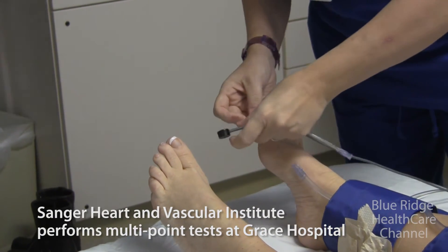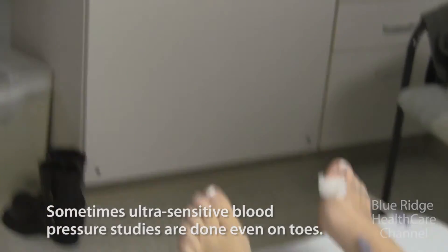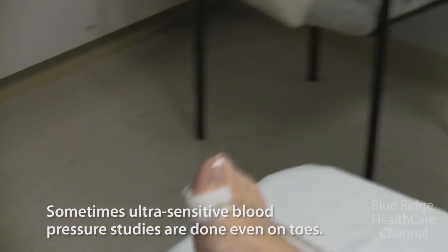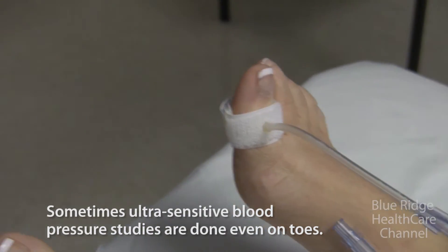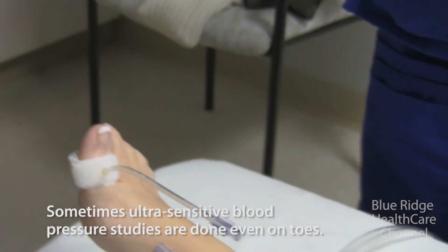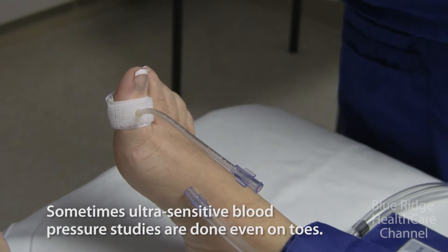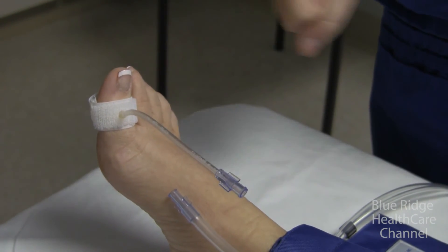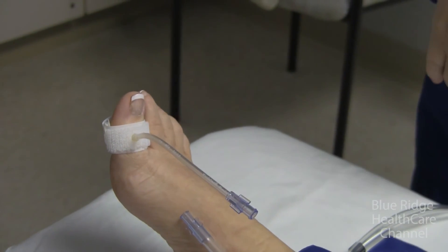With diabetic patients, they get calcium in the artery walls, so the blood pressure isn't always accurate because the cuff can't compress the artery the way it can in non-diabetic patients. It doesn't happen as much in the toe vessels, so a toe pressure is more accurate for somebody who's diabetic. Or if you've got an ulcer on the end of a toe that won't heal, you can take a blood pressure right there and see if that toe is getting enough blood.